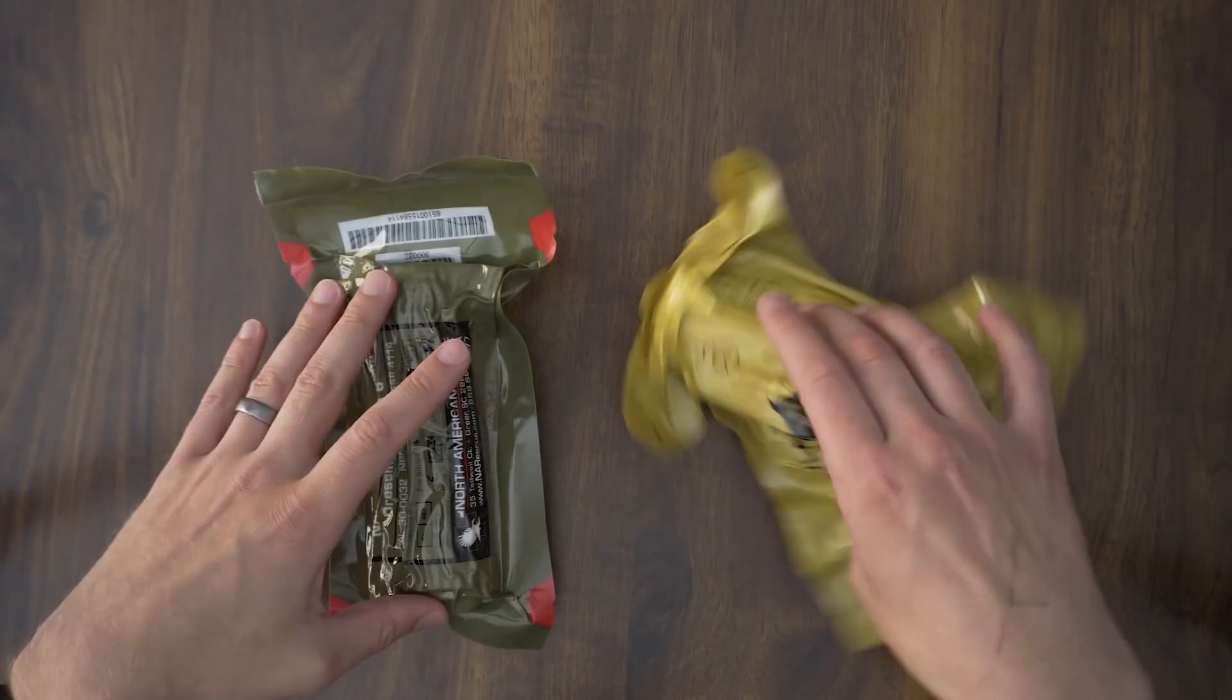So as far as packaging and what these come in, these are both the 6 inch versions of both company's products. Both come in a 4 inch version and then both have a flat pack version if the cylinder form factor doesn't really fit in your IFAC or wherever you're keeping this.